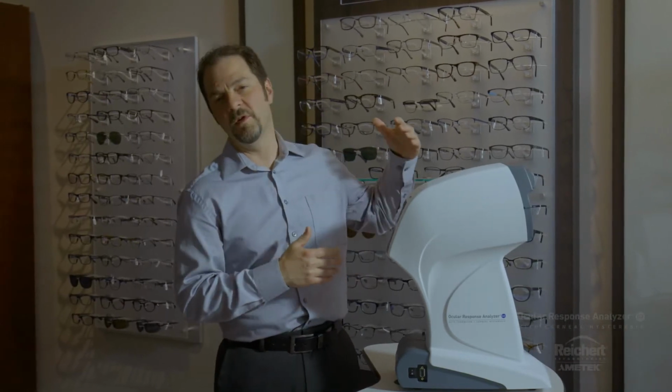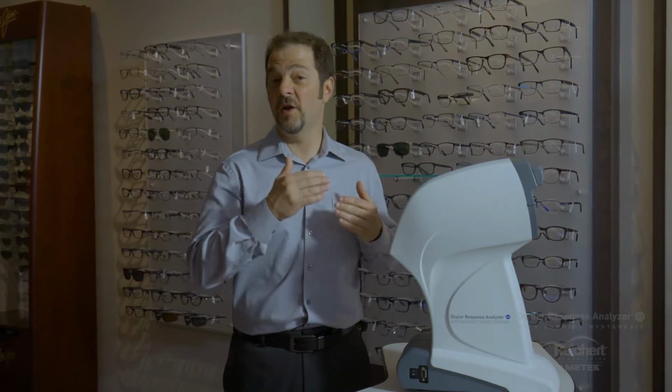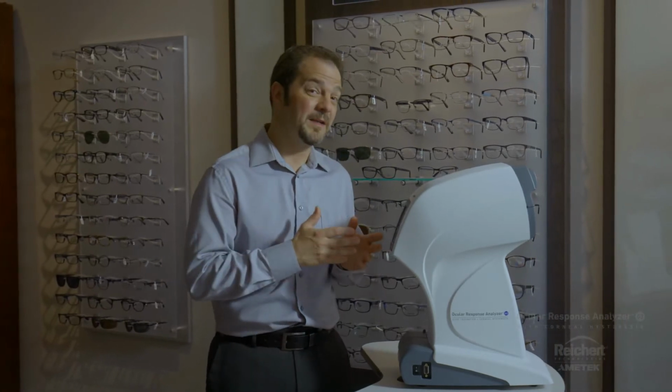If you're seeing an offset, for example, if your Goldmann is always 4 millimeters higher than the IOP-G or 4 millimeters lower than the IOP-G, and it's happening in the vast majority of your patients, well, that's unusual. The direction of the agreement or disagreement between Goldmann and IOP-G should be quite random, and it should also be fairly small in most of your patients. So if you're seeing a large offset between IOP-G and another tonometer in your practice, perhaps one of those two devices needs calibration or service. If you suspect it's the Ocular Response Analyzer, call Reichert Technical Support and we'll begin discussing the best way to address that concern for you.